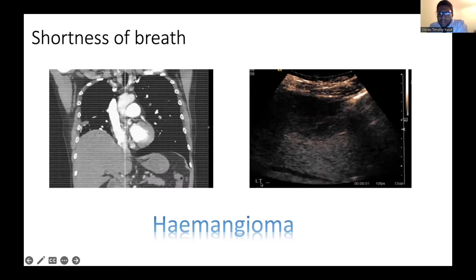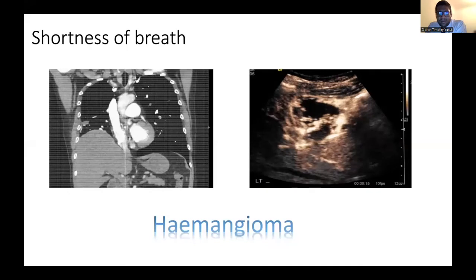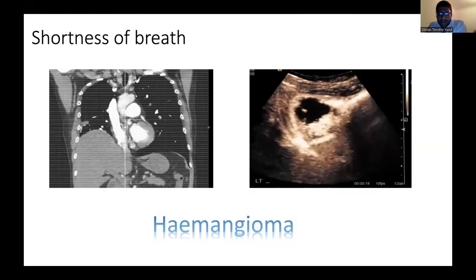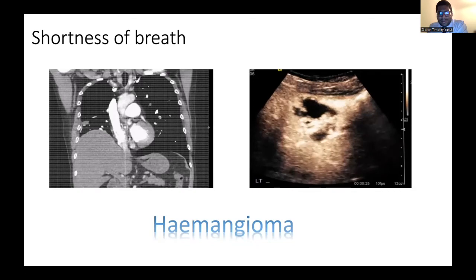So as a junior registrar, when I did this, I went down and took the ultrasound machine, because ultimately it's portable. They all have wheels, and I did a contrast enhanced ultrasound by the bedside, which shows a clear peripheral nodular arterialization of this lesion in keeping with the hemangioma. And the patient was able to be thrombolized there and then without any further risk. He's even nice enough to come back and allow us to demonstrate to other people.